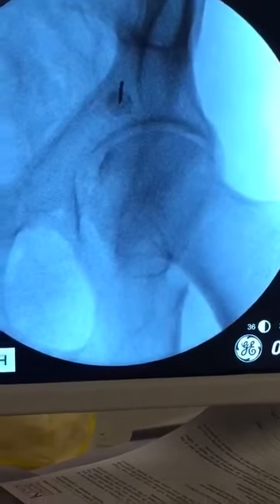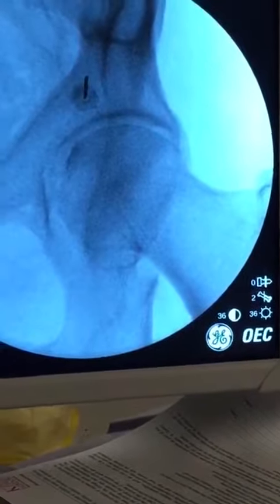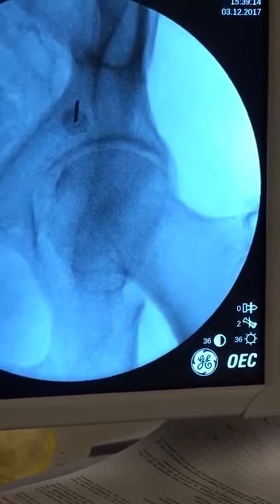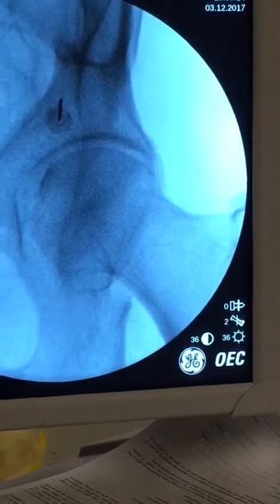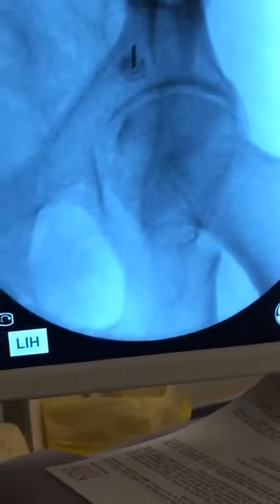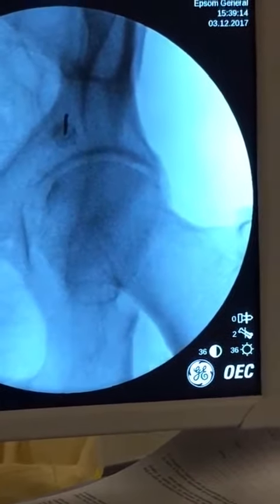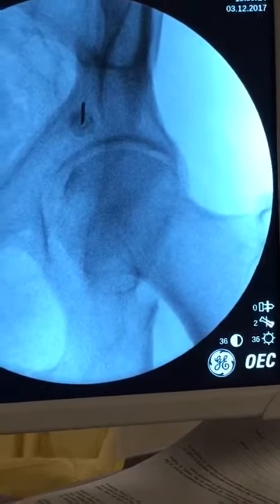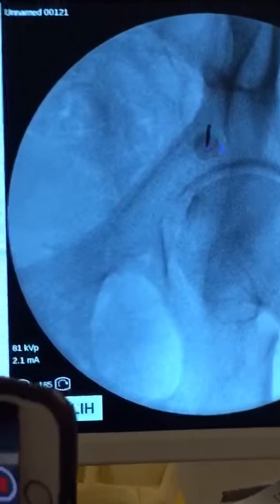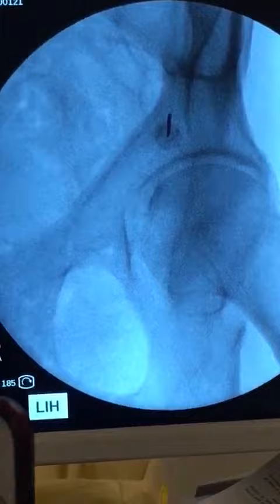I've gone in much more steeply — that's what you see. This is not a true AP view given the tilt, but that's what you want. You want to be doing the lesion in this area. If you are doing this entirely with X-ray guidance, you'll go parallel and go down. This view will prevent you from getting vascular injuries. It's very important that you land your needle along the area — you do a strip lesion.